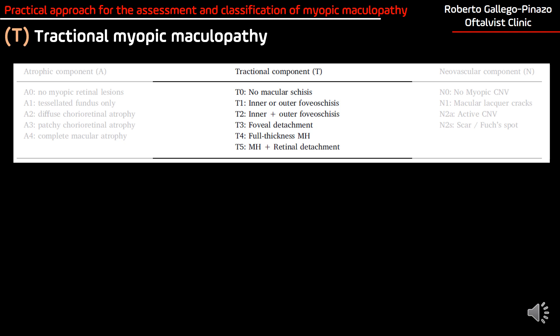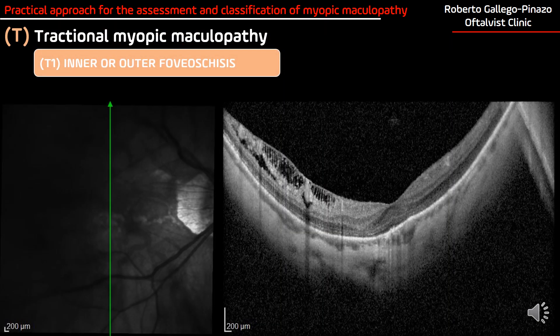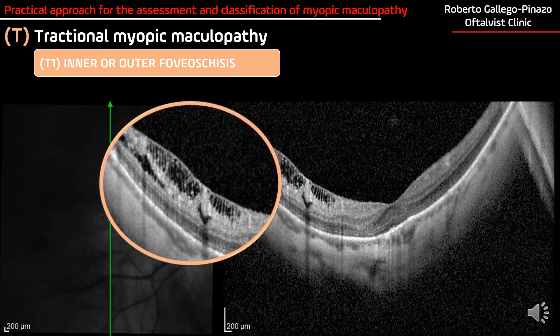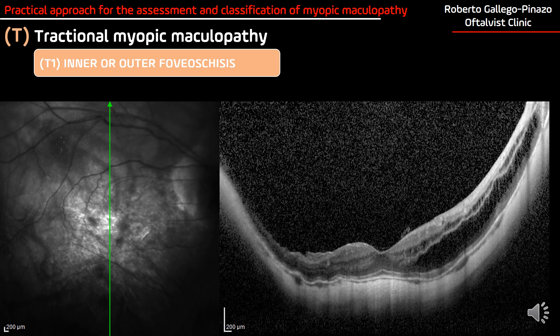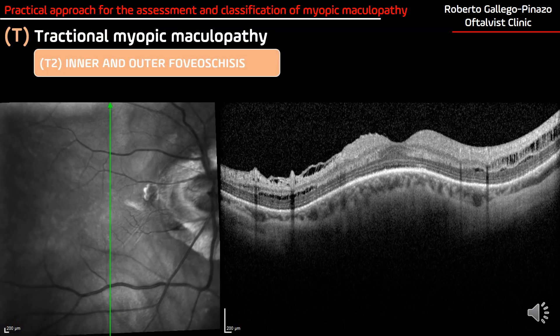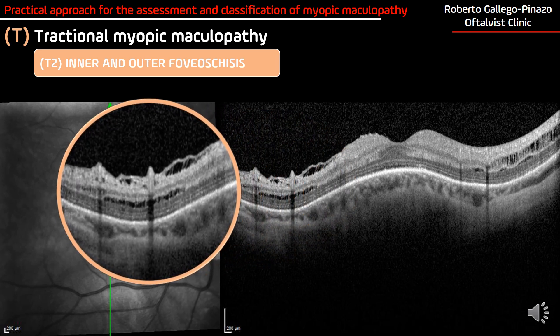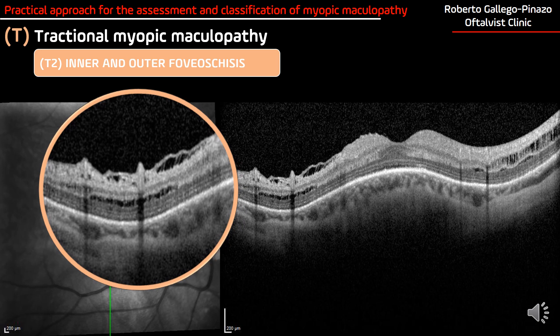Second, we have the tractional component of the myopic maculopathy. T0 is when there is no schisis. T1 is when we find inner foveal schisis, and we may also find only outer foveal schisis involving the outer retinal layers, particularly the outer nuclear layer. They may also be coincident, and then we talk about T2 stage — inner and outer foveal schisis. We can see a protrusion of a vessel, inner foveal schisis, and also schisis involving the inner retina.